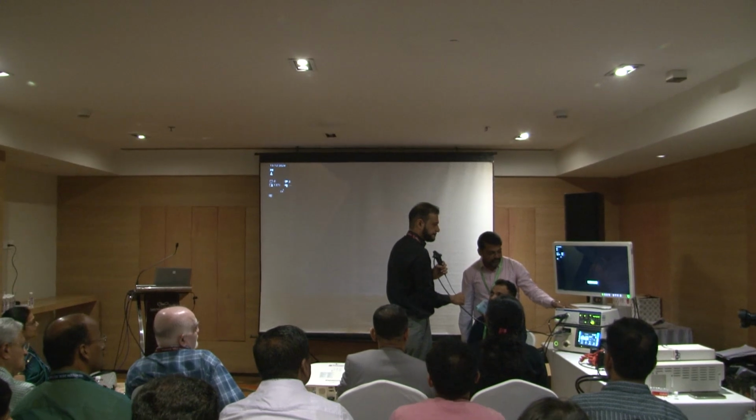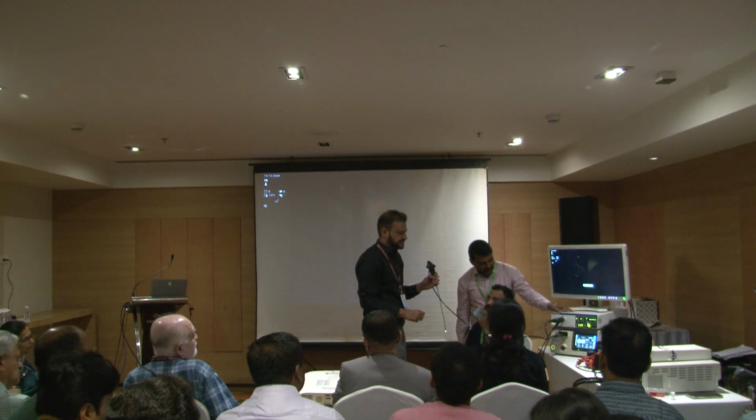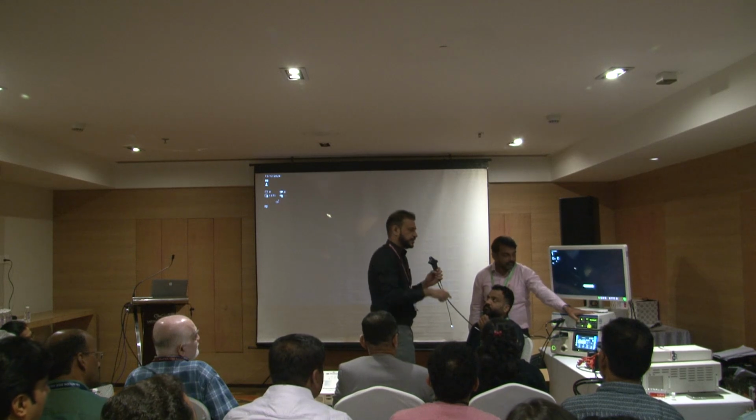As we see, it is around 121, which is the normal male fundamental frequency. First, if I report this F0, it is between 114 and 120.